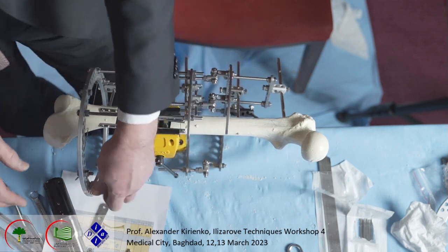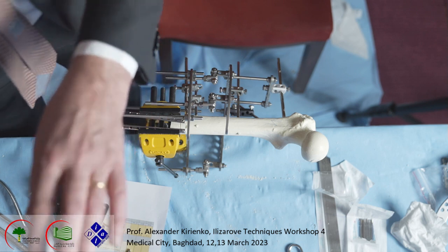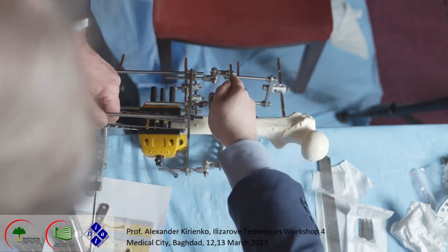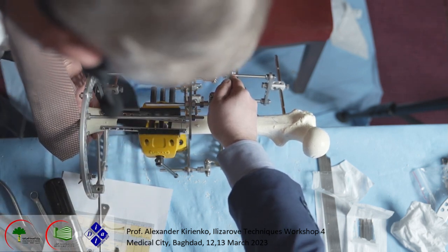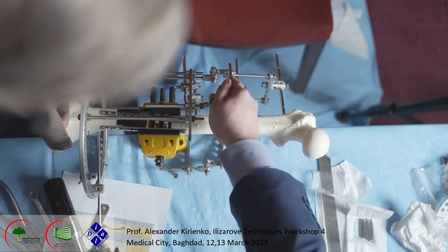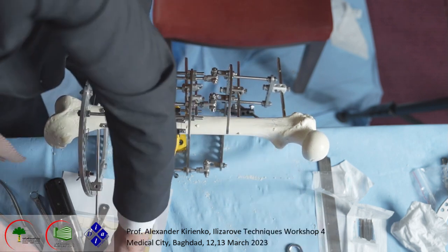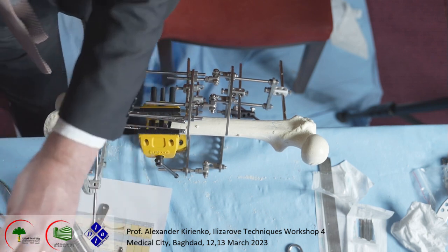Okay. Now we put this half pin. They will be crossed one with another, like this, from the posterior part. Okay, controlling with fluoroscopy, it should be not so long. Okay.